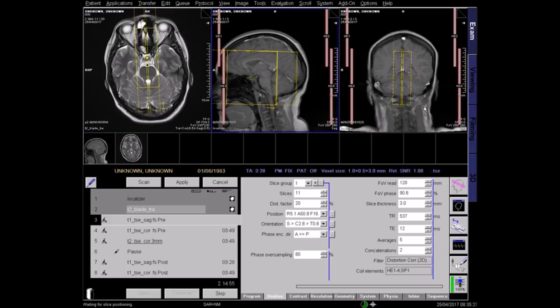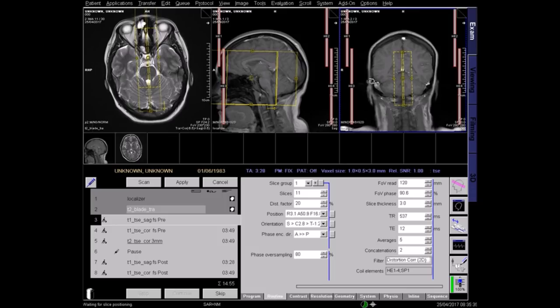In the coronal view, the block should be angled along the midline of the brain. Now apply.